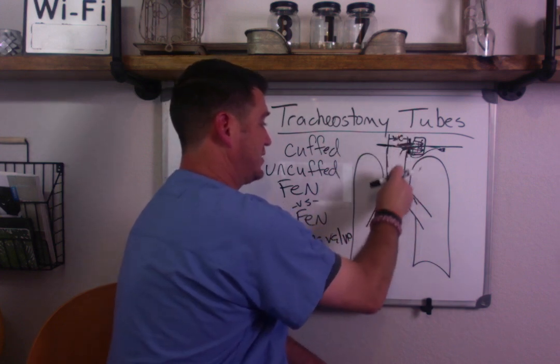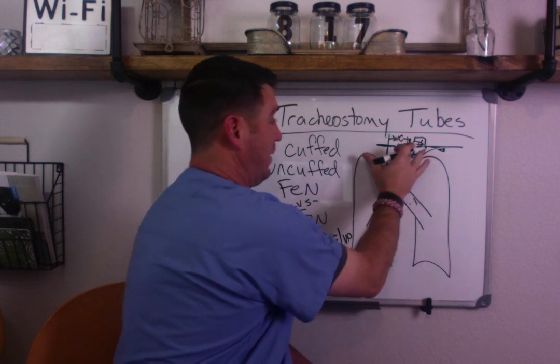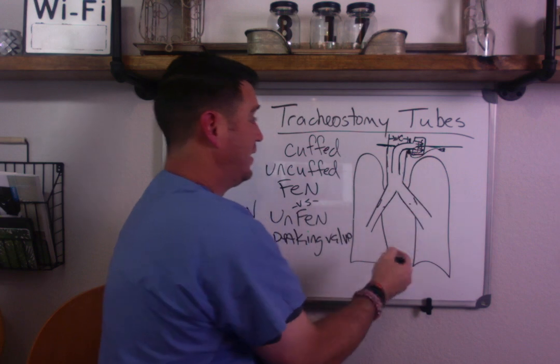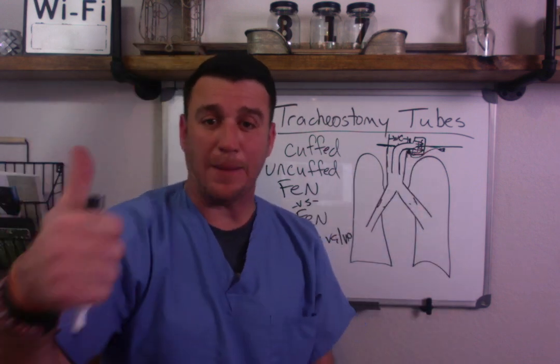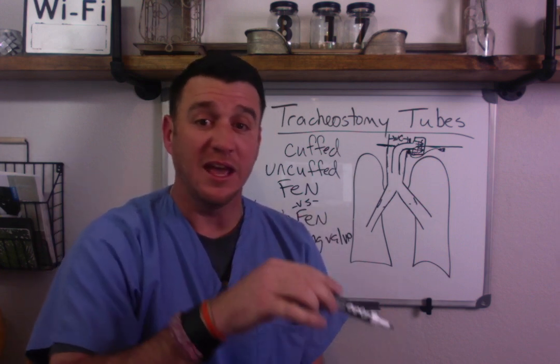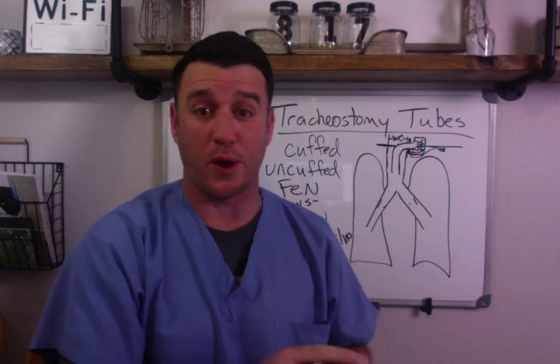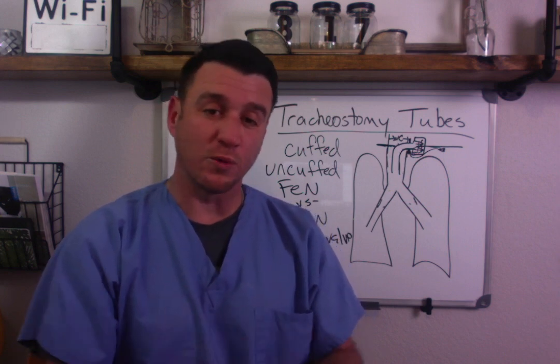And I'm going to redraw this because there's a key here I need to show. Now, I told you I was going to tell you something that might potentially save your patient's life. You put a speaking valve on your patient. One of the top things as a respiratory therapist you have got to understand is that speaking valves and cuffed tracheostomies create a potential problem that could turn real ugly real fast. And the reason is this.